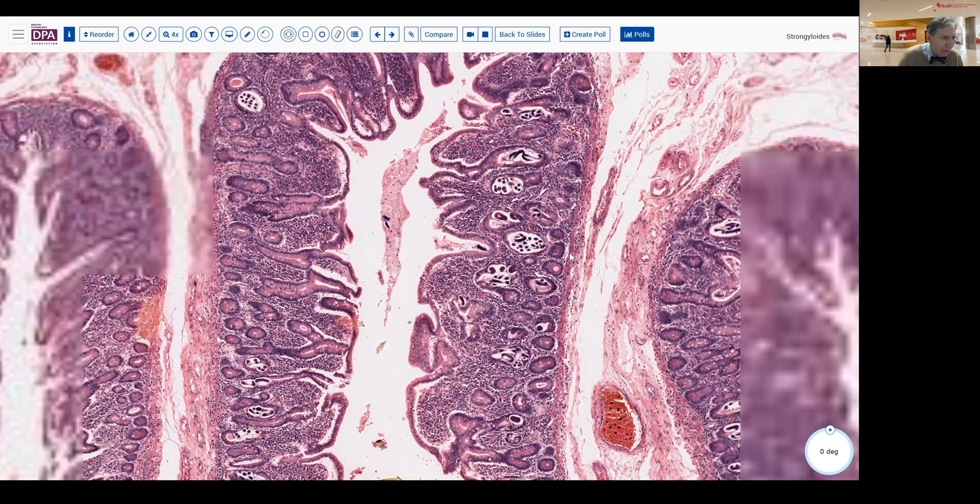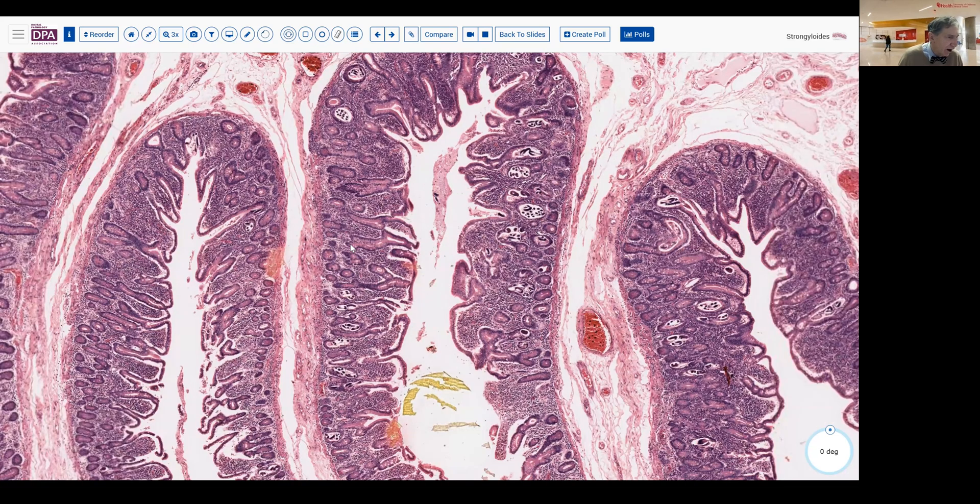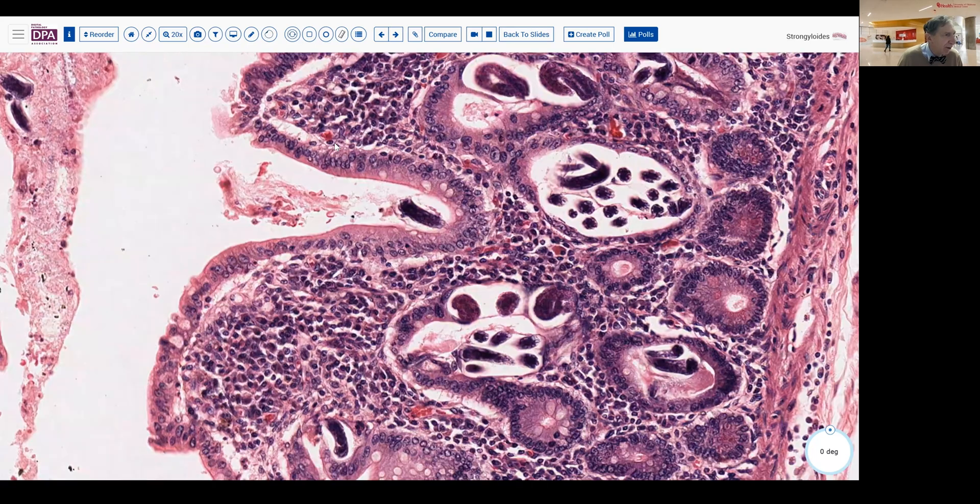Note, however, that the lamina propria, just mildly inflamed, the submucosa is not affected at all. If we look again around here, we see a little bit of eosinophilia, but nothing very striking in terms of response.